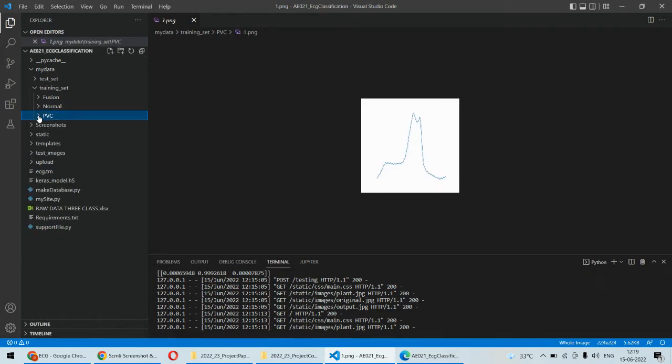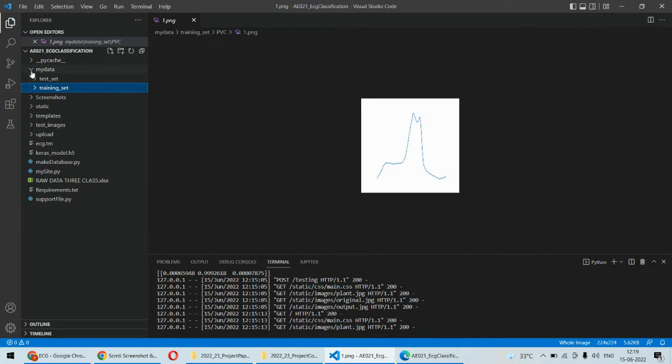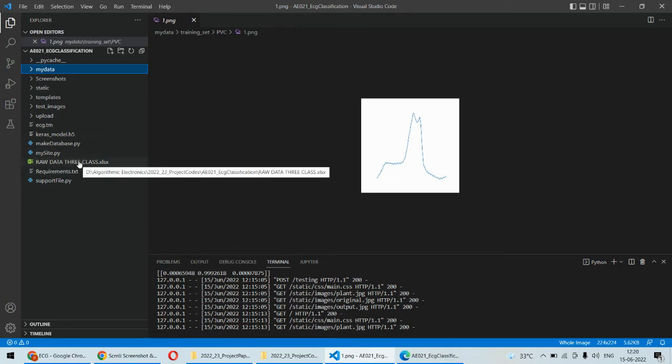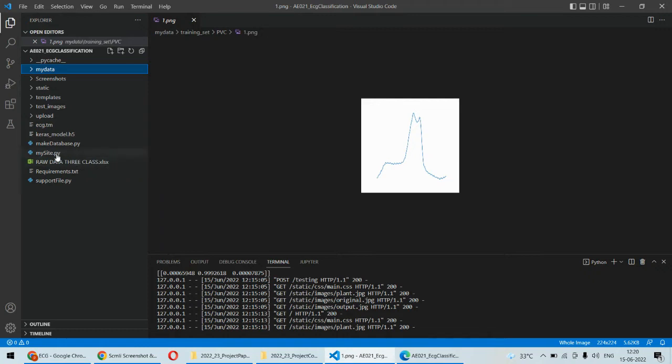Our objective is to identify which is normal which is abnormal. For that we are having this dataset and basically the samples are stored in the raw data.xls file. Here all the signal values are stored.